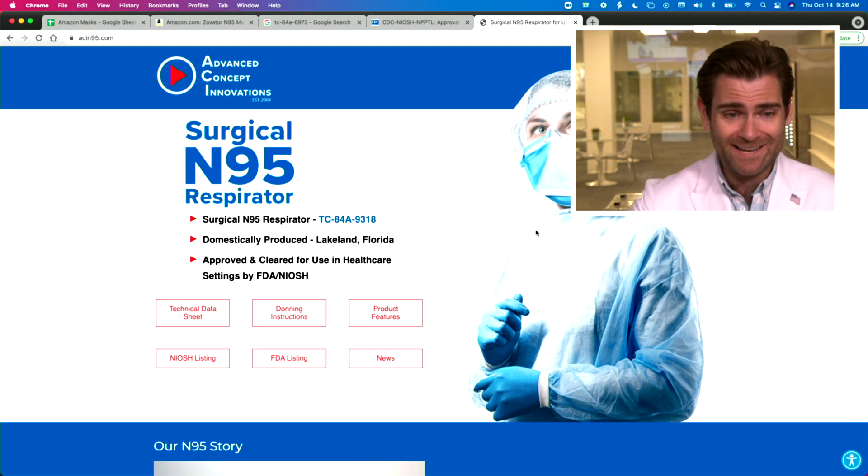Hey everyone, welcome back. We're testing every single mask in the world. Today we're looking at North American N95s and we're excited to test the ACI — Advanced Concepts Innovations — surgical N95 respirator.